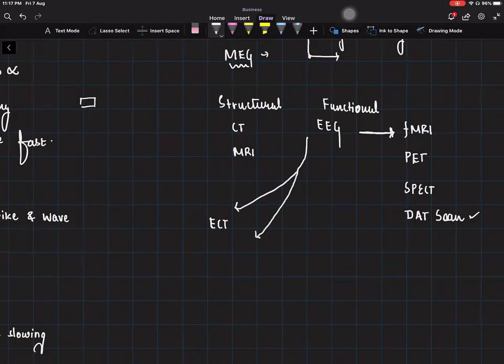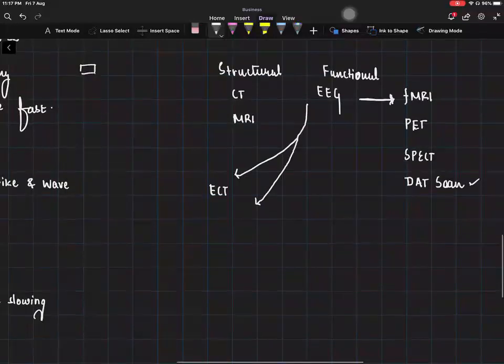So just clinically looking at the seizure won't really give you the right idea about the duration of the seizure, would it? Most of the ECT machines nowadays come with EEG monitoring, so you're able to see the seizures.